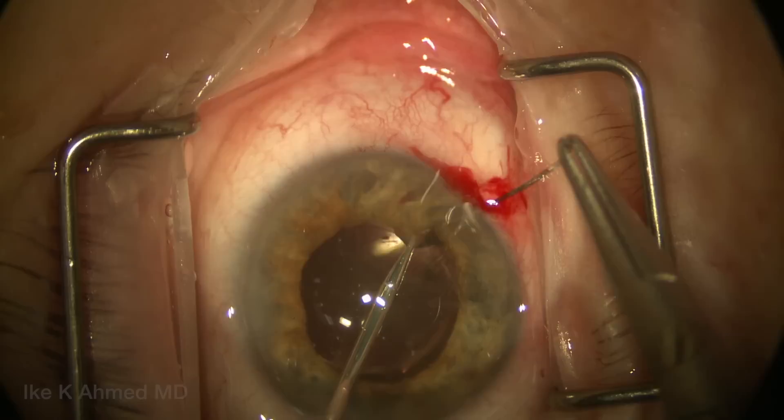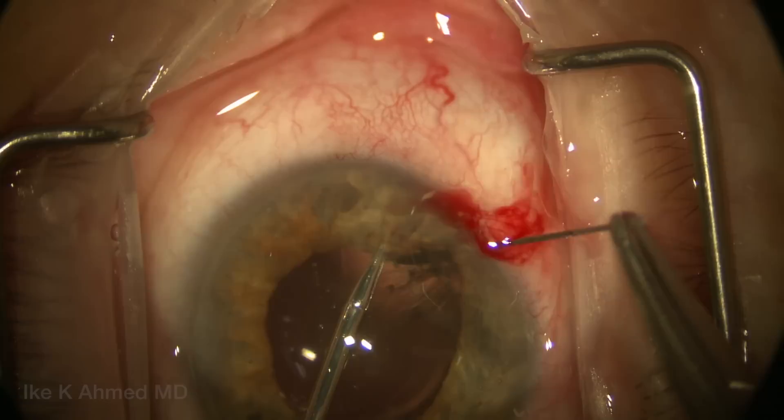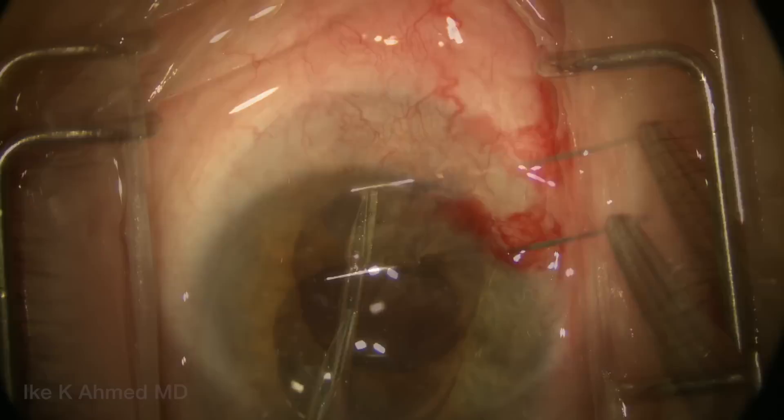For the pupillary cerclage, we take multiple bites through the iris tissue around the pupil. These bites should be as close as possible, and you can see the micro grasper here is being used to hold the iris tissue to pass the needle through. The suture technique is essentially a running baseball-style suturing technique.